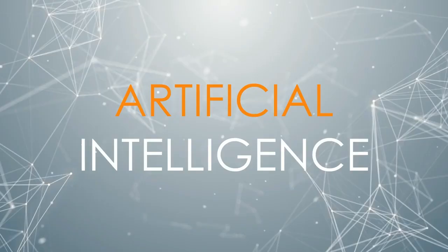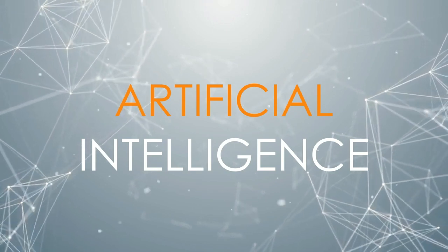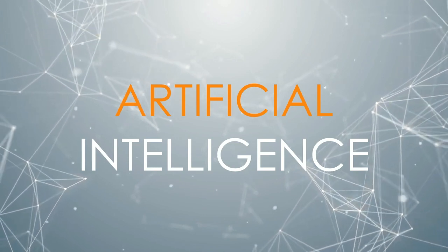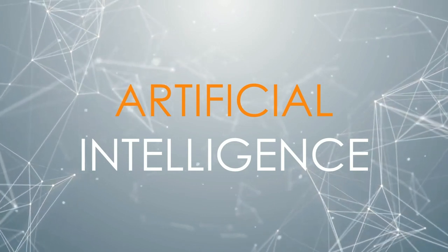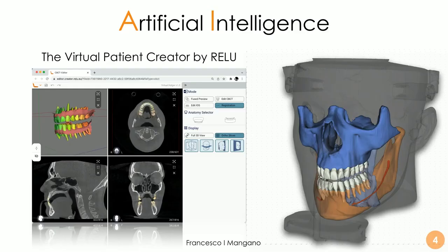Let's talk a little bit about artificial intelligence, a totally new field in dentistry, a very fascinating field. You can read a very interesting article from the group of Professor Reinhilde Jacobs, published in the journal I have the honor to edit, the Journal of Dentistry by Elsevier. We are talking exactly about the same product, a software called Relu, with the virtual patient creator, a very valuable tool to create a virtual patient and to merge all the information of the patient within a single project for our planning purposes.